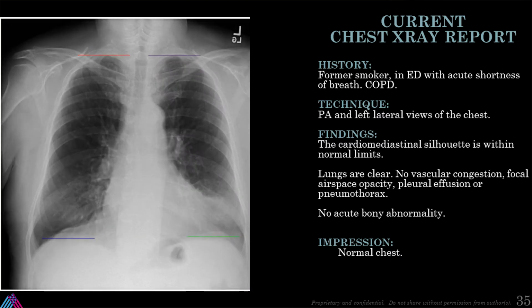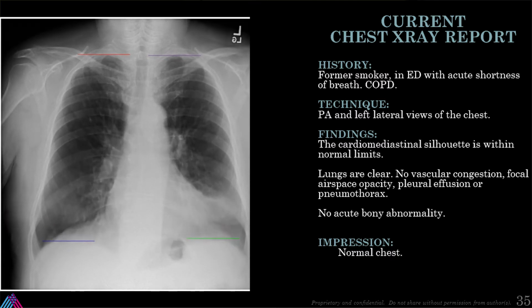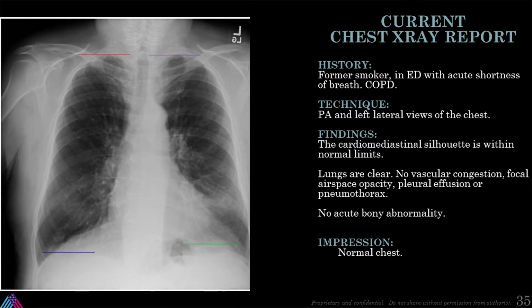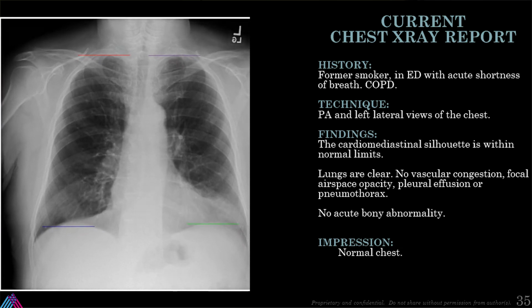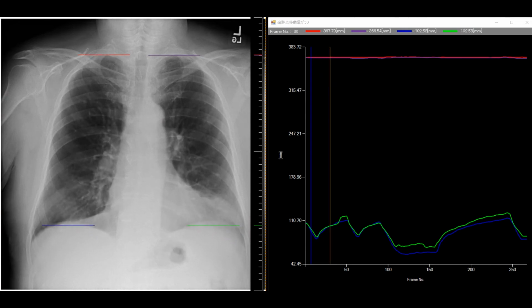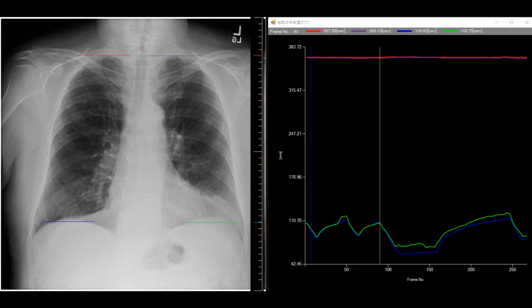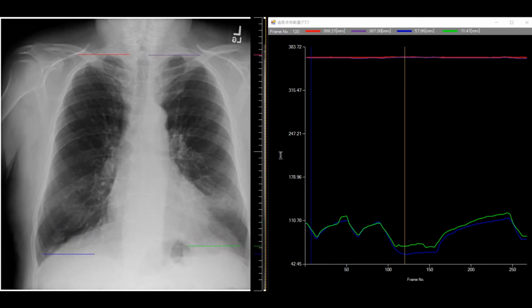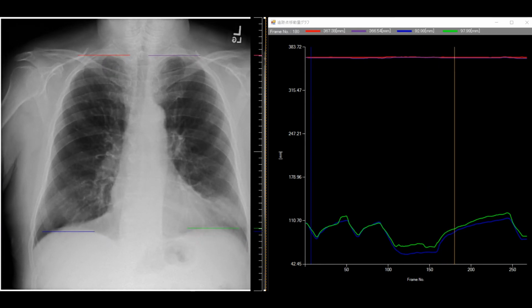But what I think was really interesting is just watching those lungs move now. It seems like this person's getting caught on their breath, right? Like it's not completely contracting or where it should be. It seems like there's hyperexpansion of those lungs, and there's flattening of the diaphragms later on in the breathing cycle. And just to convince you, we're going to remap those diaphragms. It's not as smooth as the prior image that we had shown before, those graphical representations of the diaphragm moving in sync. It feels more rigid in this diagram, and it's being shown in that graph.